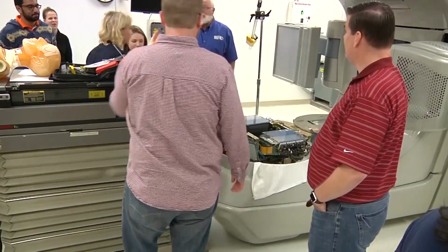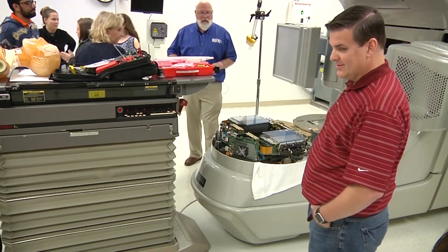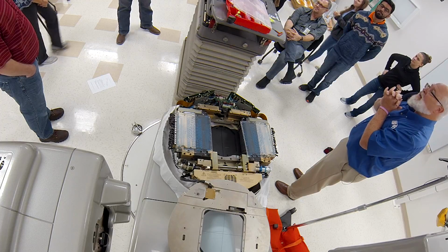So everyone replaced the motor and tested it, right? Okay. Thank you. So who wants to go hit WR and initialize? Let's make sure it actually works.